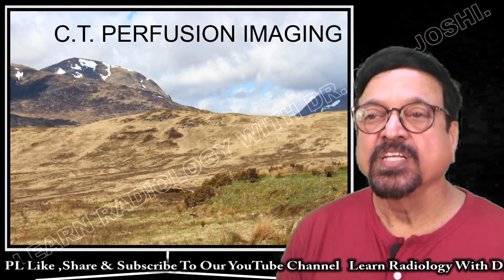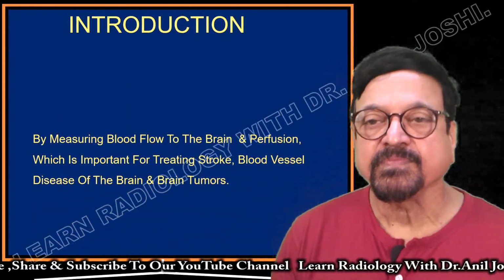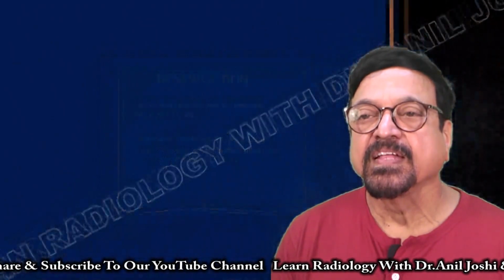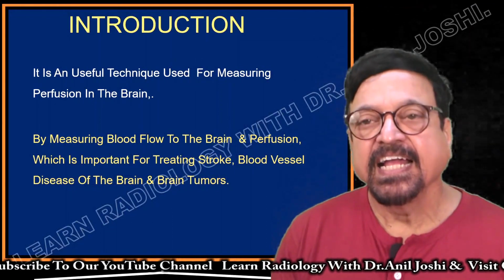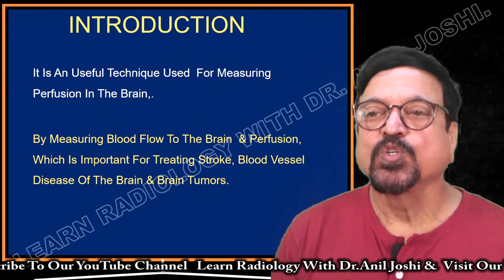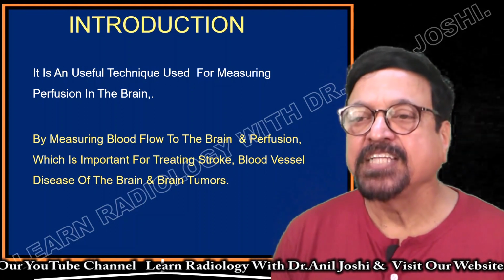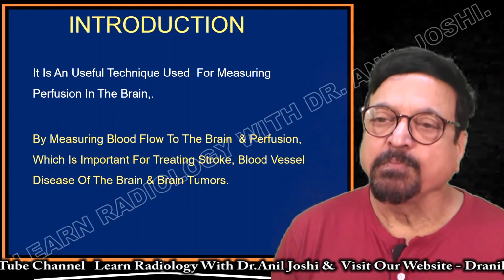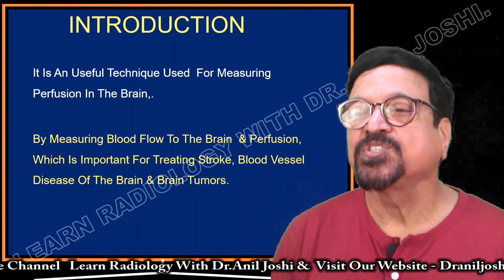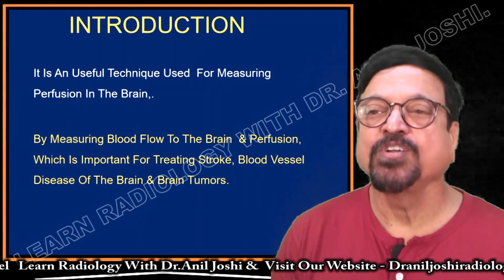Now, let's come to CT perfusion images. Introduction. It is a useful technique used for measuring perfusion in the brain, by measuring blood flow to the brain and the perfusion, which is important for treating stroke, blood vessel diseases of the brain and brain tumors.